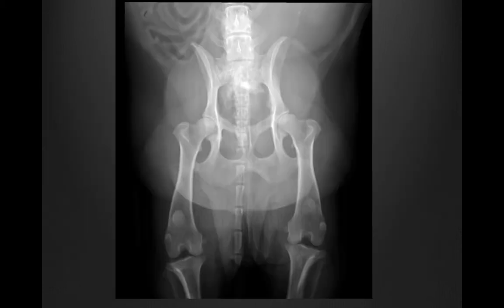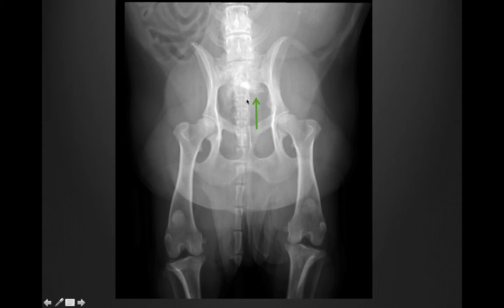On the orthogonal view, we're going to see some mineral right here, which is not clearly associated with the pelvis — that's representing mineral in our prostatic mass. On the medial aspect of the left ilium, we have some new bone formation, which is concerning in a dog with prostatic carcinoma, as I'll discuss later, because we worry about metastatic disease there.